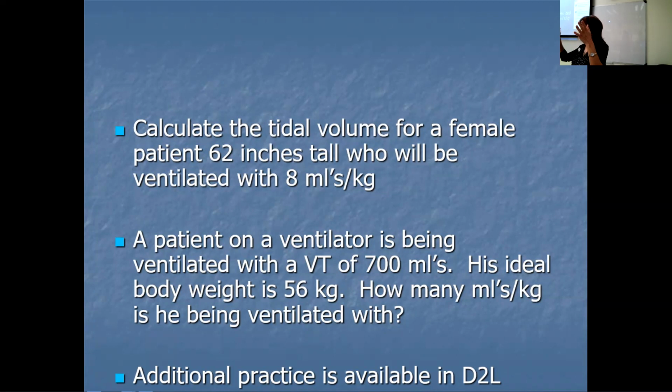And then you're going to get the ego trips that say, that's what I put on there, and that's where it's going to stay. And at that point, you have nothing to do. I don't know who you report somebody like that to. Older physicians are not on board with the damage that big tidal volumes cause to the lungs. So you approach them, you talk to them, and they just stand their ground and say, no, that's what I wrote, so that's what you follow. So you come across that a lot too, unfortunately. But yeah, that's way too much tidal volume for that patient.